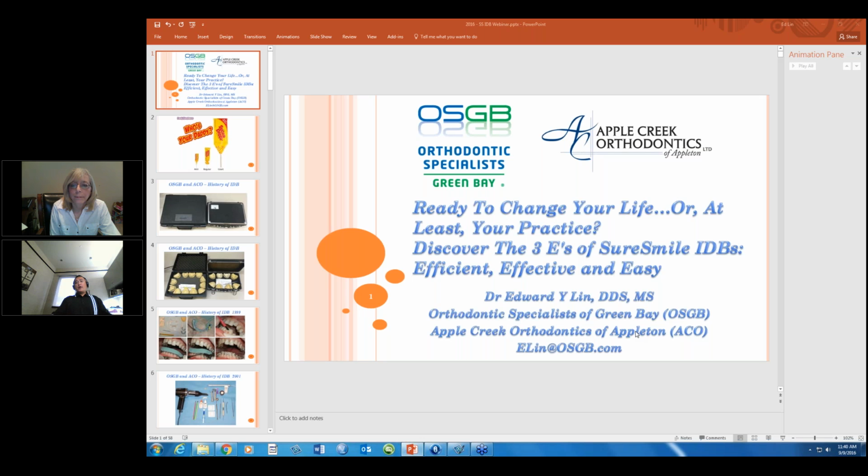So I'm not a straight wire guy. I'm a SureSmile doctor, so this is just one bracket application philosophy for me in my practice, and then I transition to SureSmile. Now, if it's something that you want to play with more with straight wire simulations, then you're going to have to spend the time with bracket positioning, running that straight wire simulation to see where it ends up. And I know that there are guys out there that are doing it, so I'm not one of them, so that's about as much as I can comment on that.